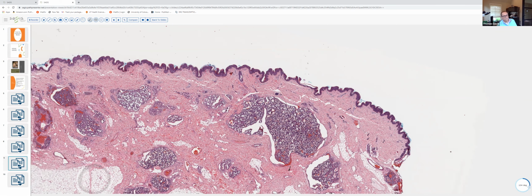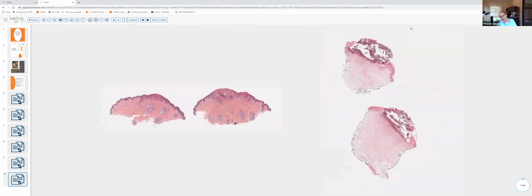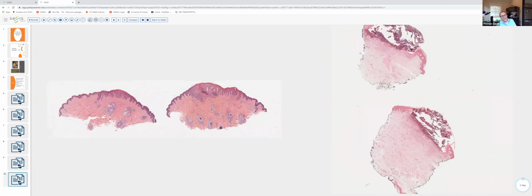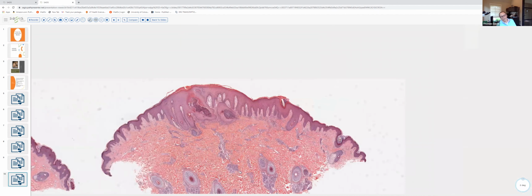Okay. Our last case, we're going to look at a couple of disorders that both are characterized by perforation. We have elastosis perforans serpiginosa on the left, and reactive perforating collagenosis here on the right. And what's characteristic about EPS, well, there are a couple things that are characteristic.